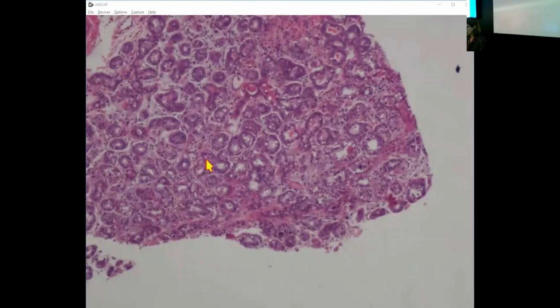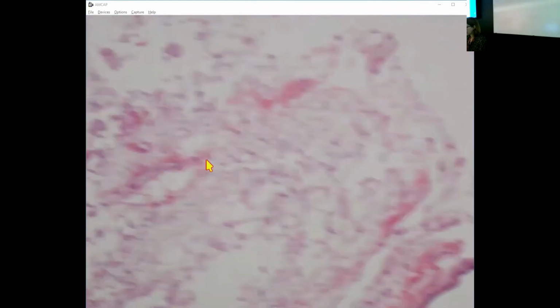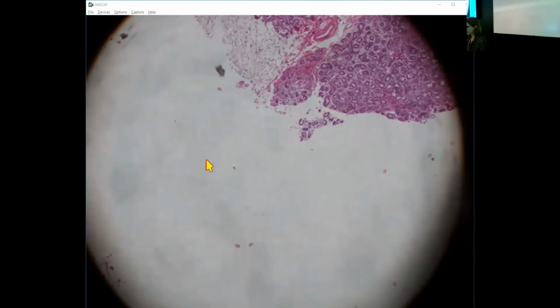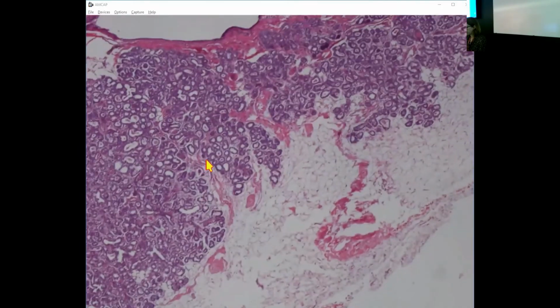Okay, so this 61-year-old with pleomorphic calcifications. Oh no, not a 61-year-old. I made up a wrong history. Sorry. Yeah, this is a younger patient.